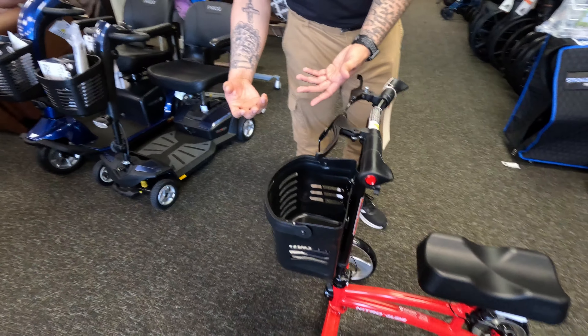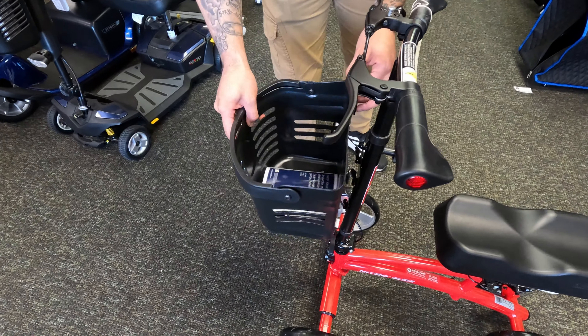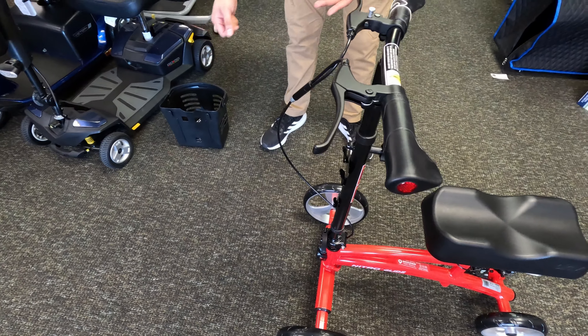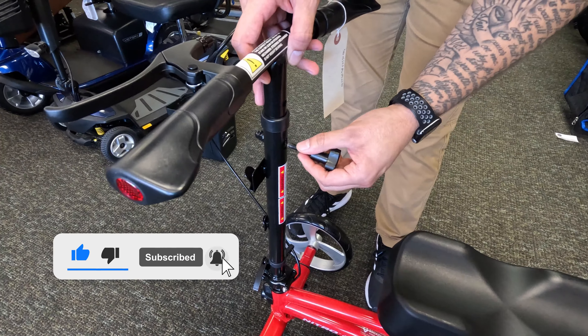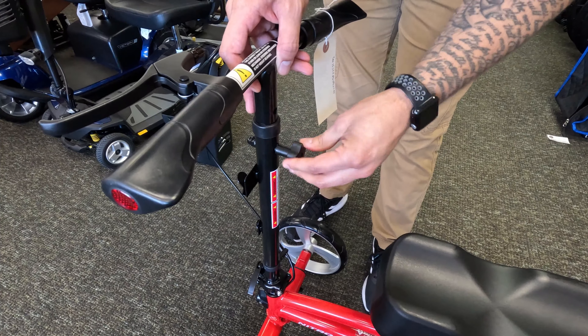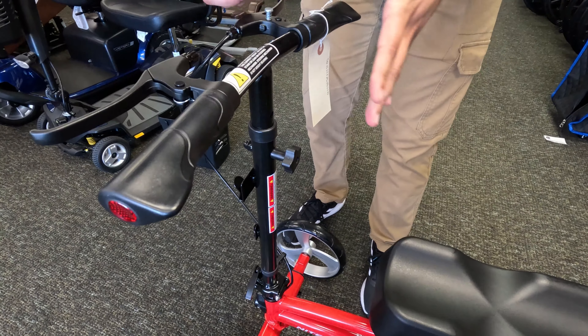We're going to go ahead and go to the basket now. The basket is attached by these hooks, so you just lift up just like this. We'll put this over here so you can see how we adjust the handles. With the handles, you're going to want to just unloosen just like this, get it to the desired height, turn it to the right just like that, and make sure that it's locked in.